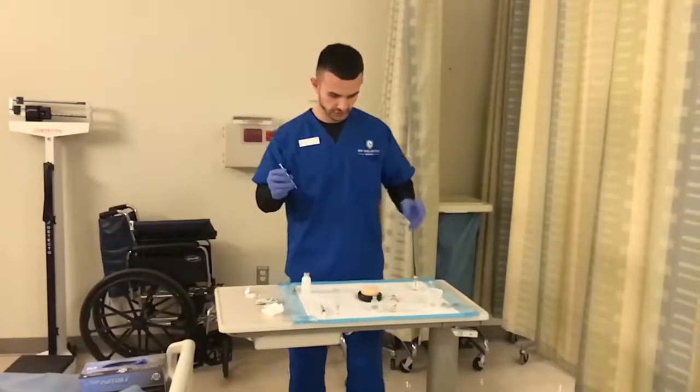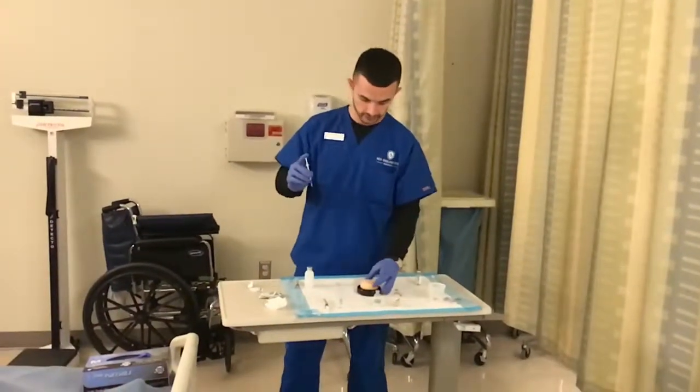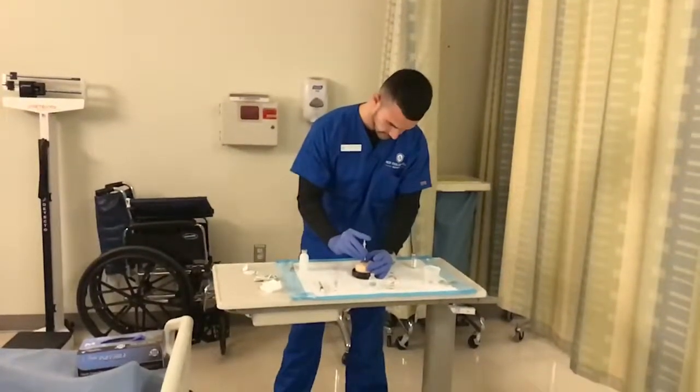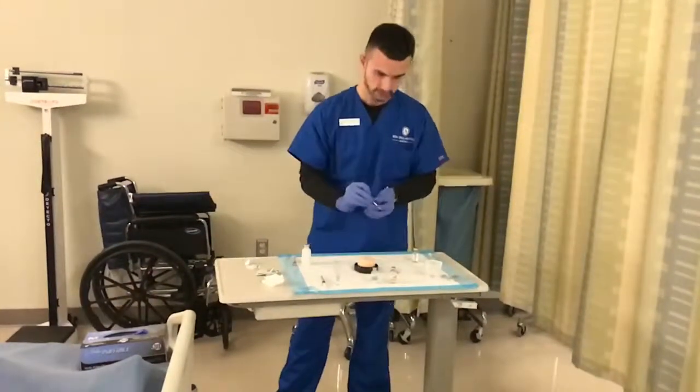So again, with this injection, you can give it at about a 45 to 90 degree angle. You pinch the patient's skin, insert the needle, inject your medication, and put that in your sharps container.